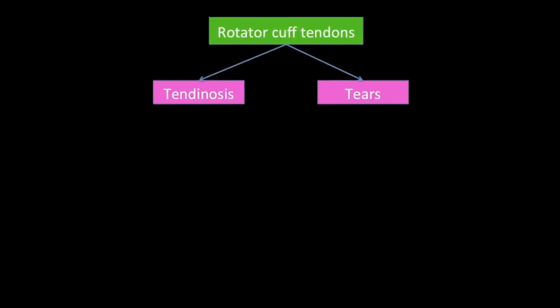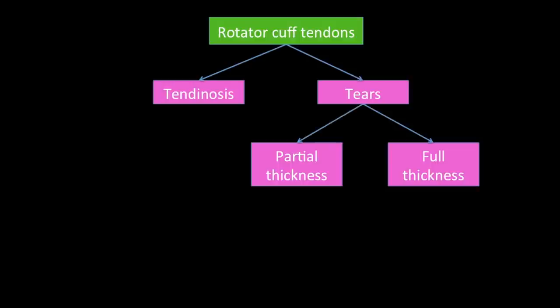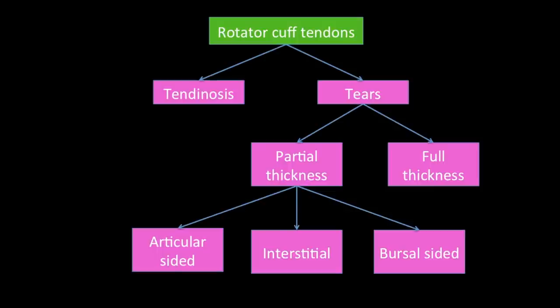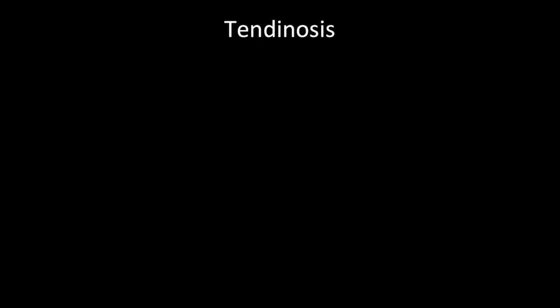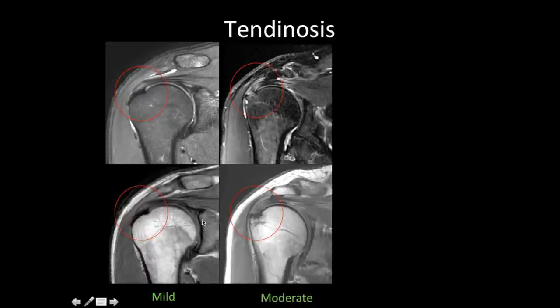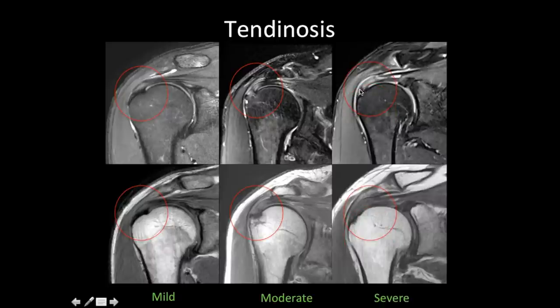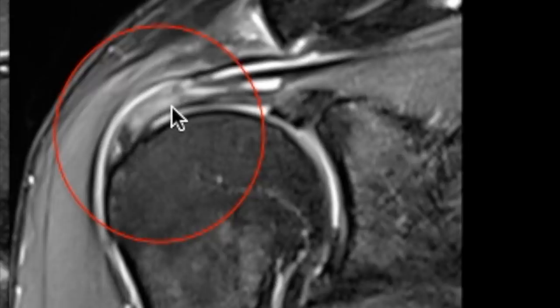When assessing rotator cuff tendons, first decide whether there is tendinosis or a tear. In case of tears, determine if it is partial or full thickness. Tendinosis should be graded as mild, moderate, or severe. Mild tendinosis shows some hyperintense signal within the tendon; moderate tendinosis involves increased length of tendon involvement with brighter signal; severe tendinosis has even brighter signal but still not as bright as the adjacent subacromial bursal fluid, confirming tendinosis rather than a tear.